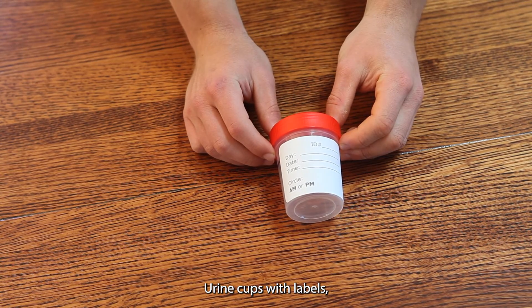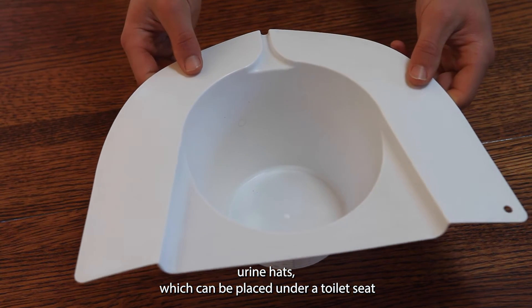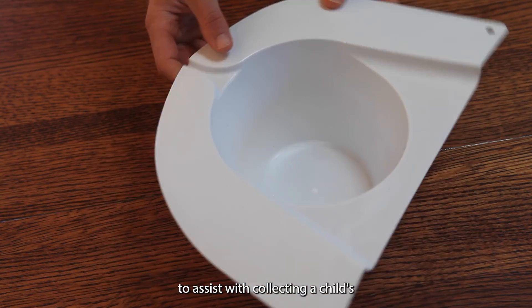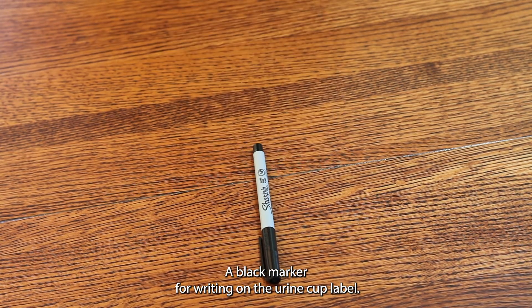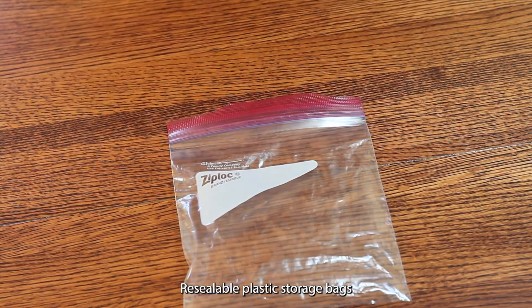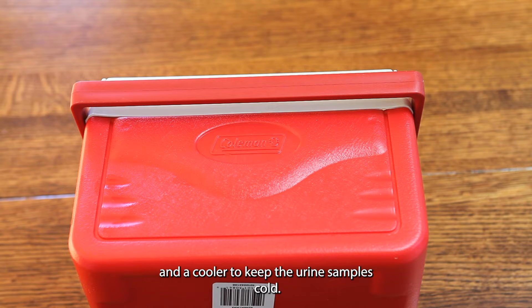Urine cups with labels. Urine hats, which can be placed under a toilet seat to assist with collecting a child's urine sample if needed. A black marker for writing on the urine cup label. Napkins. Gloves. Re-sealable plastic storage bags. Gel packs. And a cooler to keep the urine samples cold.